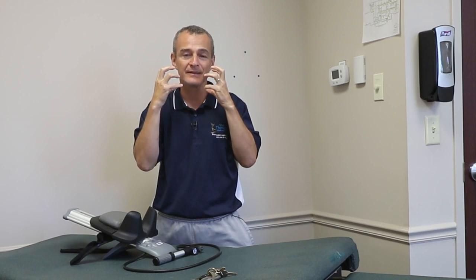So just real quick, why don't I like the over-the-door model? They sell them for 25 to 50 bucks. The problem is you have to overcome the weight of the head already because you're sitting up. There are some that let you lay down, but nonetheless, the way they come around the neck and under the chin and press up into the jaw tends to irritate some of the joints within the face.